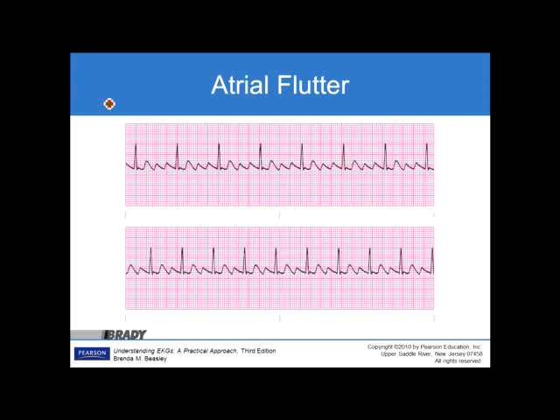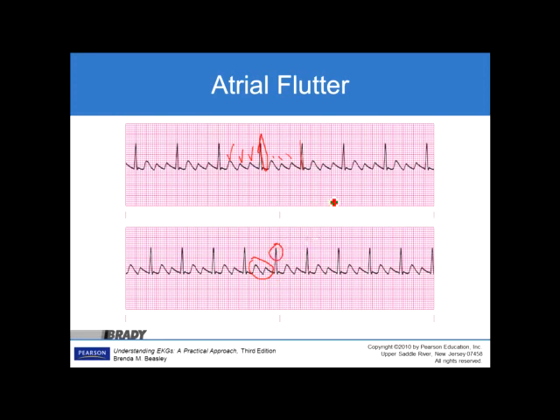Identifying atrial flutter on the strips: the top strip is atrial flutter with 3 to 1 conduction — three sawtooth waves for every one QRS. The bottom strip also shows atrial flutter, with shark-teeth sawtooth waves between the QRSs at 2 to 1 conduction. Top: 3 to 1. Bottom: 2 to 1.